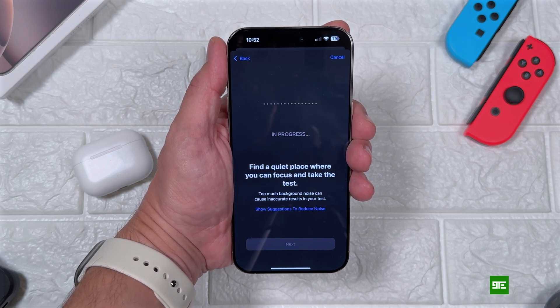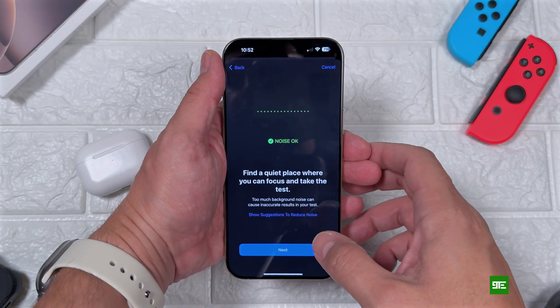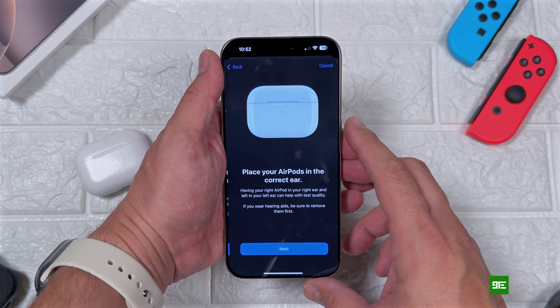You will be asked to go to a quiet place so that you can take the hearing test effectively. If there's too much noise, you will see an indication on your iPhone. If not, you will see 'Noise is okay.'